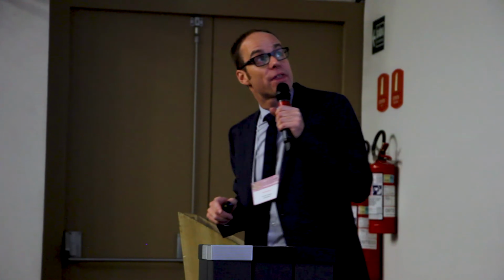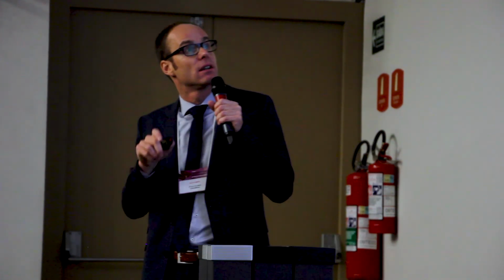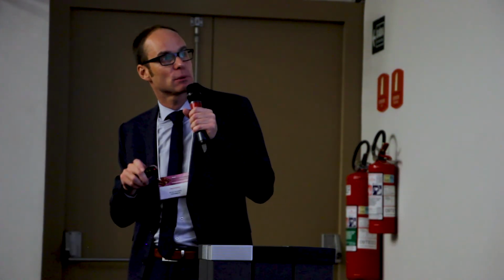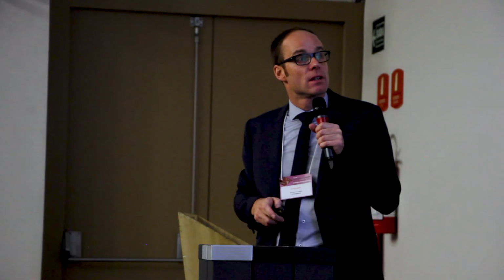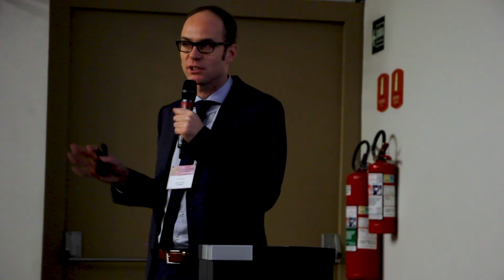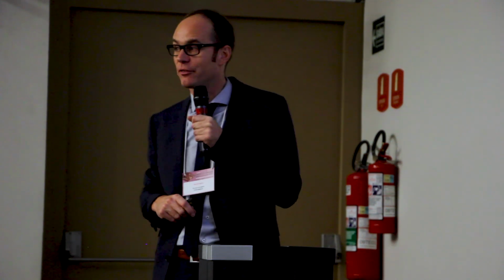Okay, so with these automated systems, we really eliminate the IFA drawbacks, which are time-consuming incubation, time-consuming evaluation, and subjective evaluation. So paperless workflow I already mentioned, and this was just a short introduction into the possibilities you have for automated IFA. Thank you very much.